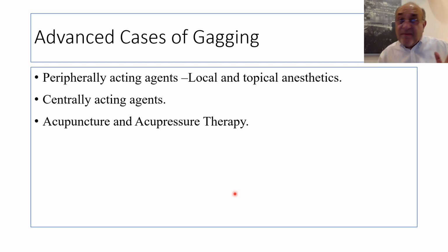It doesn't work. If the patient has a gagging reflex and you are rough, or the dentist or his assistant is rough during taking the radiograph, the local anesthetics will not work. It's a matter of being gentle to the patient.